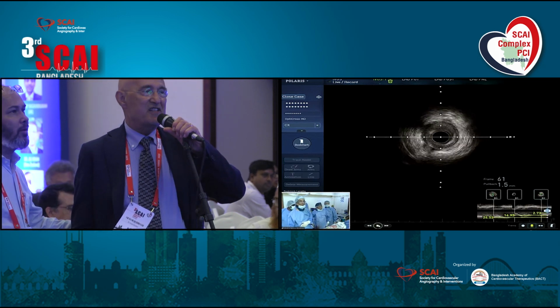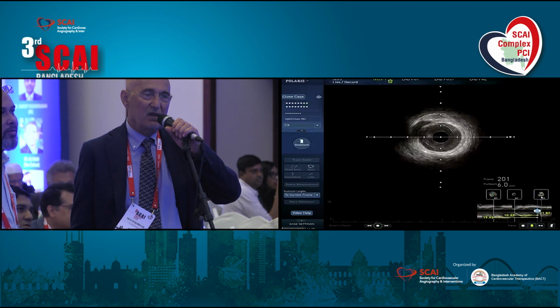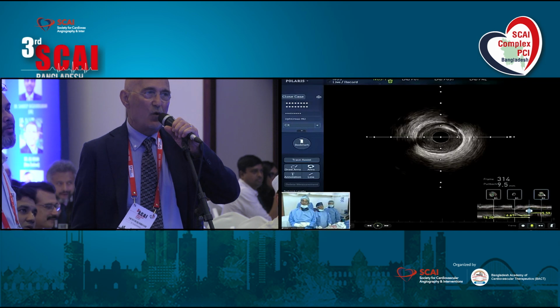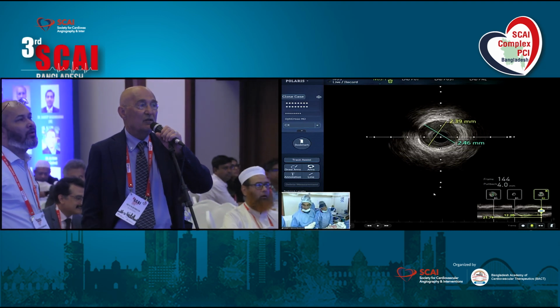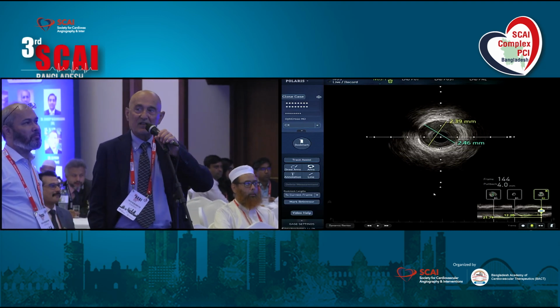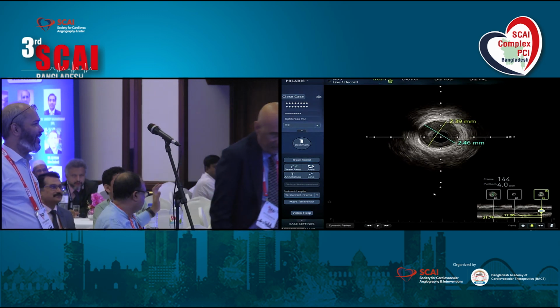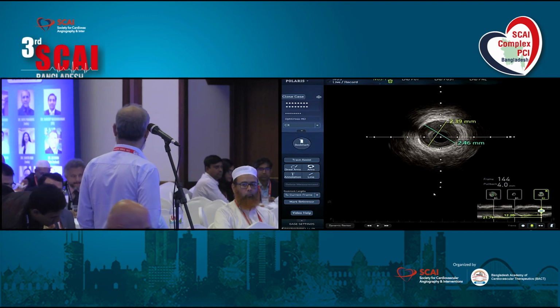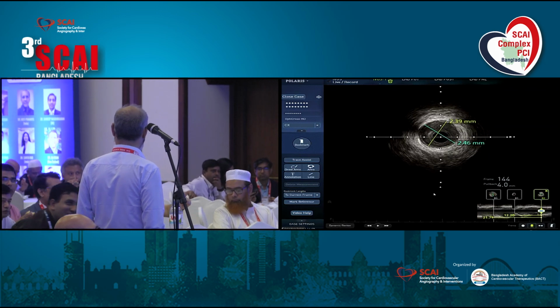Thank you. Actually, it is a focal stenosis, distal stenosis. I think that if you have a good result with balloon, only balloon can be left, with 70-80% probability of a definitive result. That's all right, Dr. Guzman. If it were a DCB, then nothing goes wrong and we can be happy.